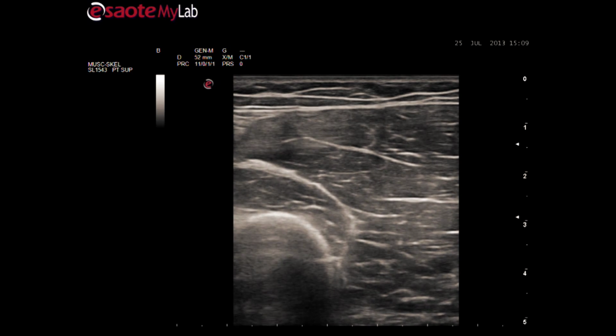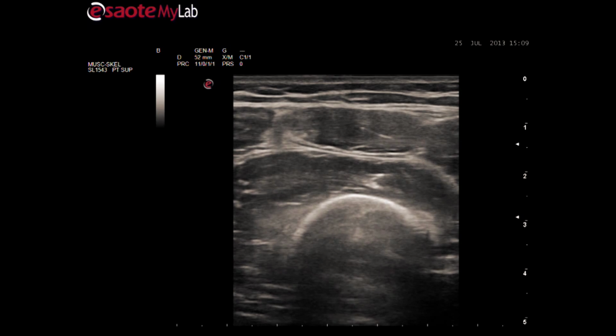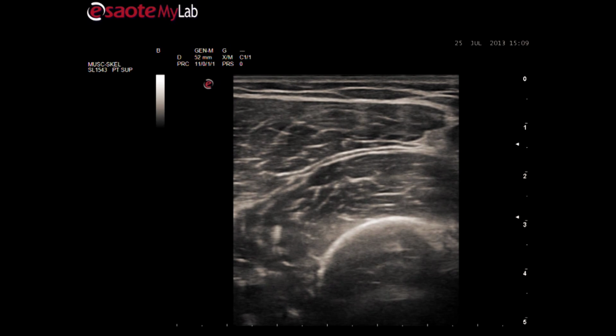Can you see the little white fibers inside the muscle? This is endomysium, connective tissue surrounding the muscle fibers. We return to the central upper leg to see the rectus femoris again, now a little muscle. The underlying vastus intermedius is still quite big.